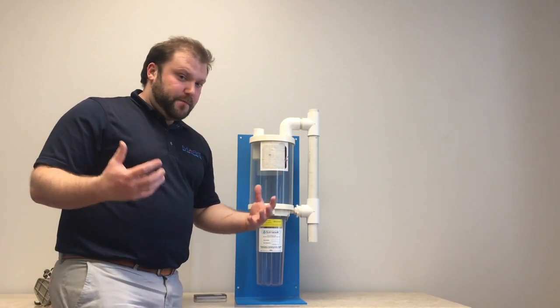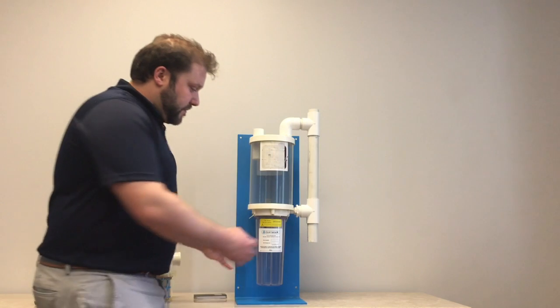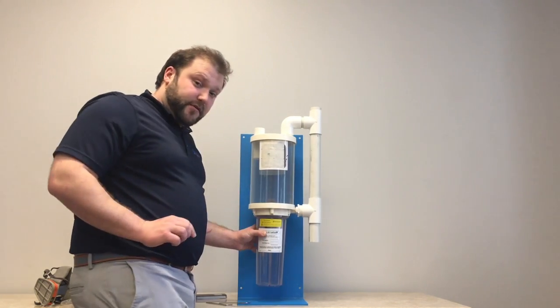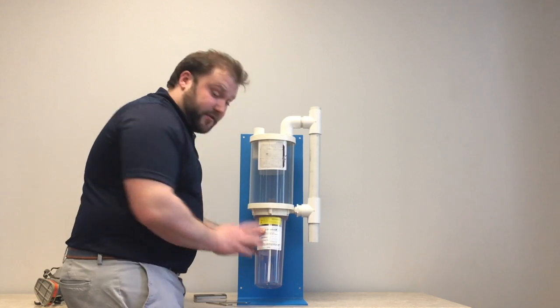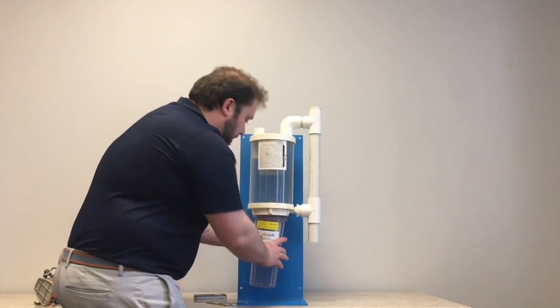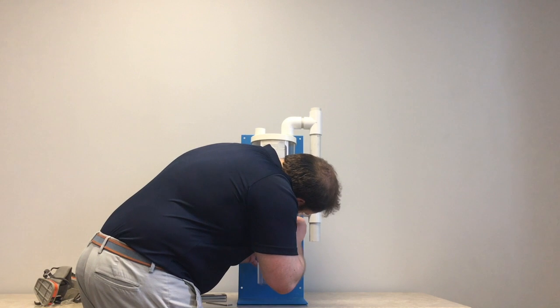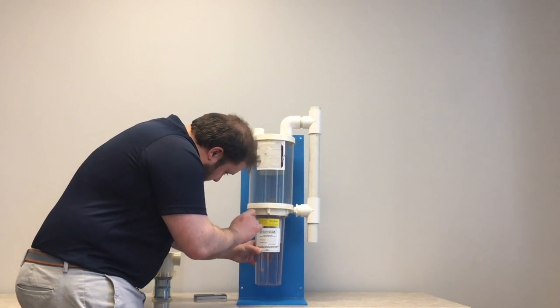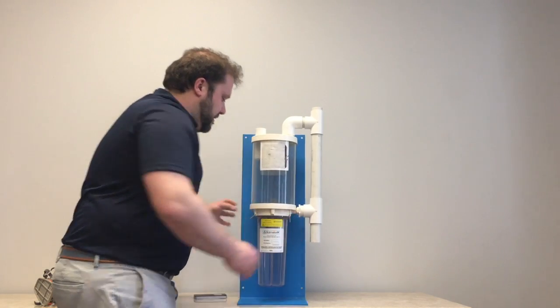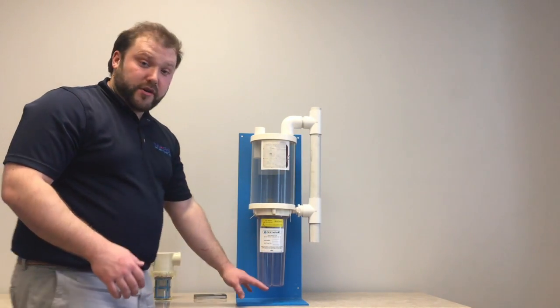Once we have all our safety equipment on, we're going to try to remove the blockage in the upper chamber and bring it down to your empty filter. Leave your suction running. You're going to pull your pins, and the suction will help keep the filter in place, and you're going to tilt the filter slightly. What this is going to do is allow air into the inlet, jostle things around that may have been causing the clog, and then you're going to put the filter back, put your pins back in, there we go. Come back in 24 hours. This should allow anything in the upper chamber to fall into your empty filter.